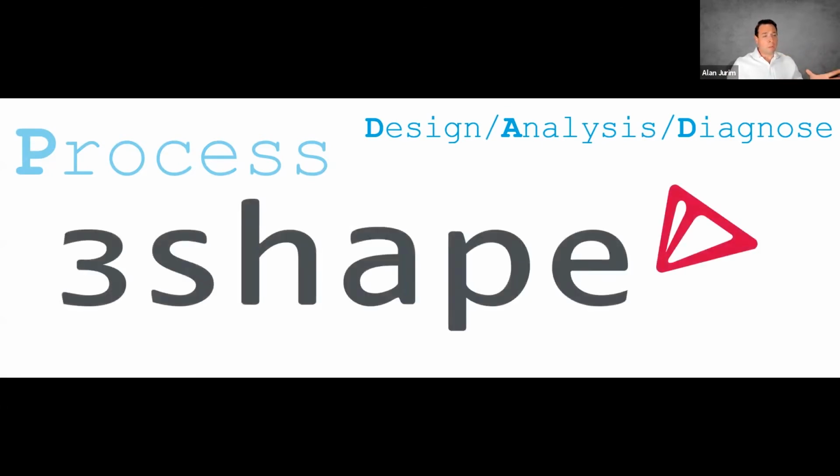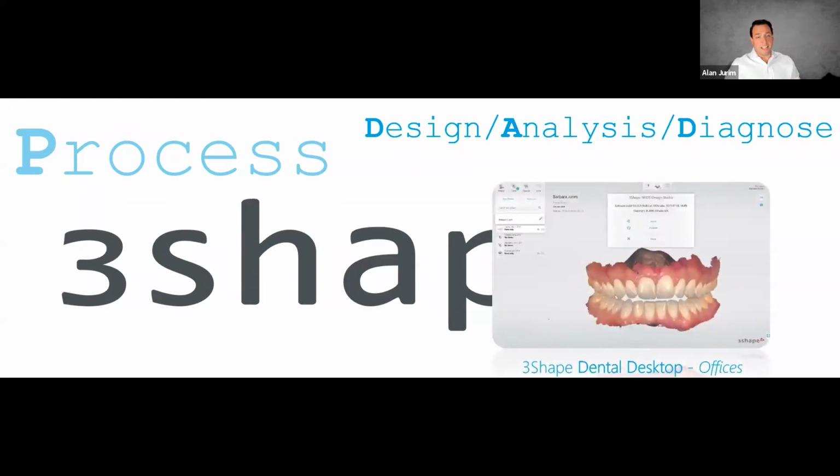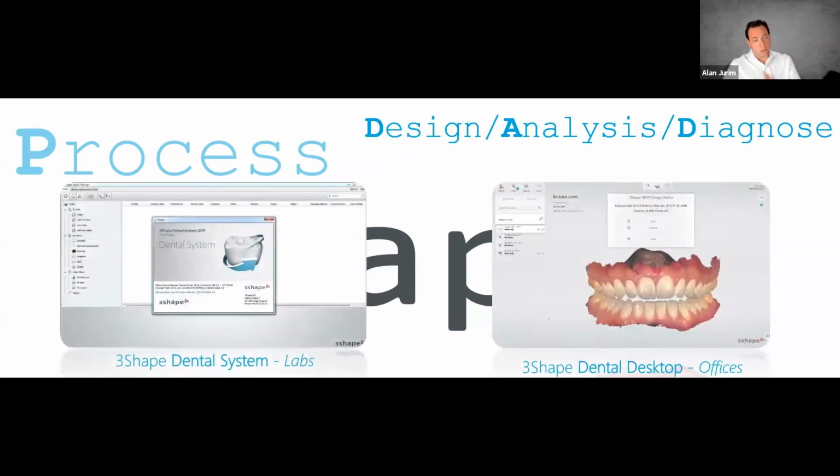And 3Shape is probably one of the biggest partners that we use in this realm. 3Shape is a company that develops both software and hardware for a lot of the digital workflows. In fact, they have office workflow software that dental offices use when you scan. They have laboratory software, and they go back and forth.